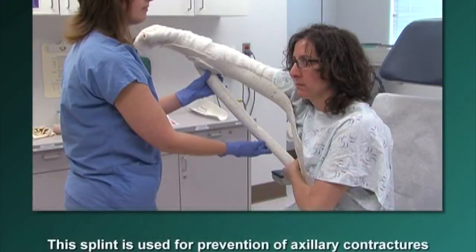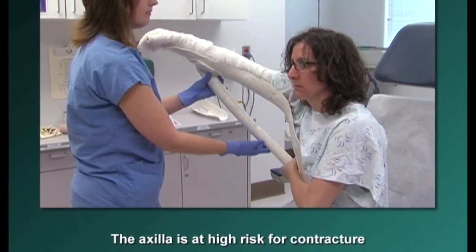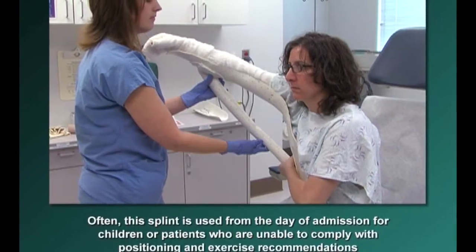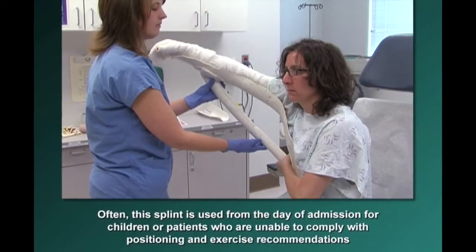This splint is used for prevention of axillary contractures. The axilla is at high risk for a contracture. Often, this splint is used from the day of admission for children or patients who are unable to comply with positioning and exercise recommendations.